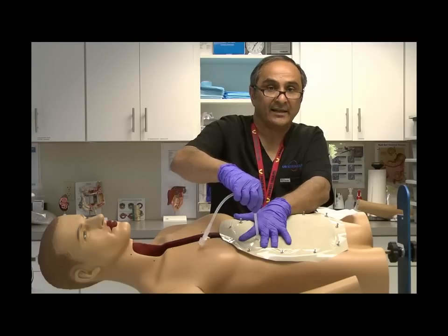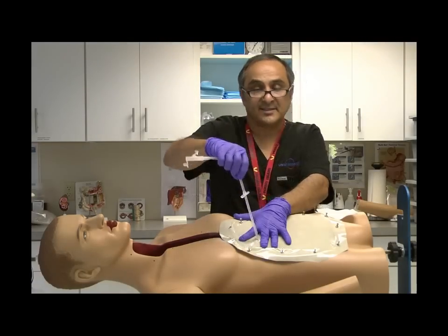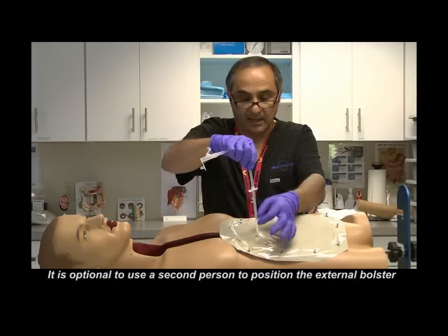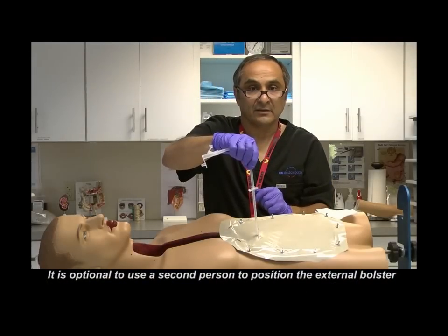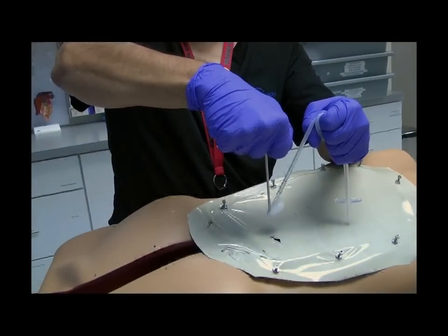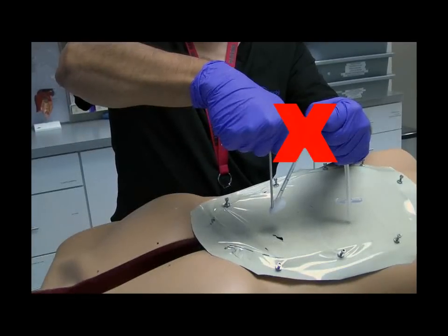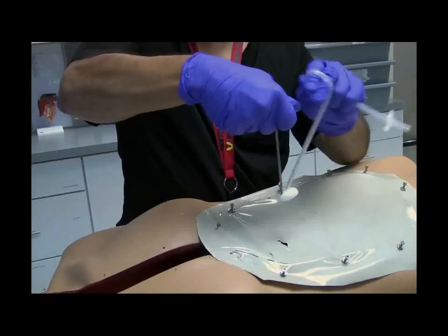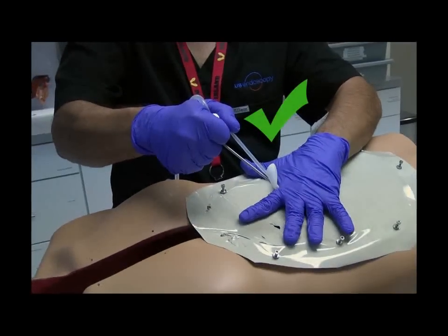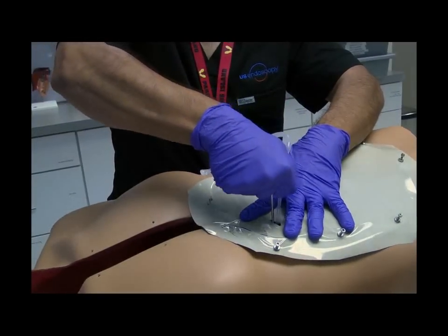I gently tug on it to assure that it's in the proper placement. And then at this time, I can secure the external bolster with the help of my assistant near the skin. Occasionally, you may see a 2-handed technique used for placement. That is incorrect. Again, the proper technique is stretching the device with 1 hand and controlling the obturator, using the second hand to stabilize the tissue, and then place the device.